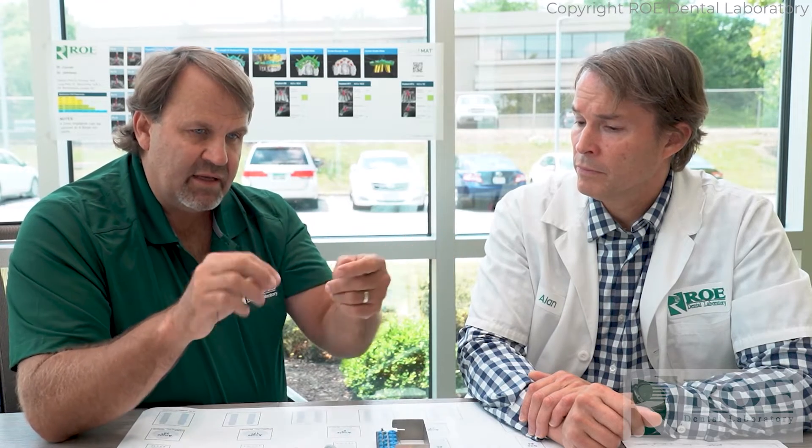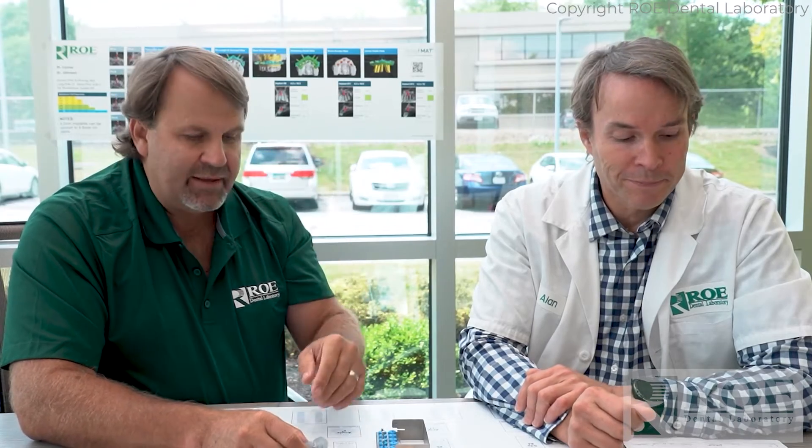A useful tip: take a mirror, remove the head from it, and use it with your mallet to tap the pins. It fits perfectly in the mouth and keeps everything out of the way — you don't need to manage the lip separately. This gives you better control while tapping.